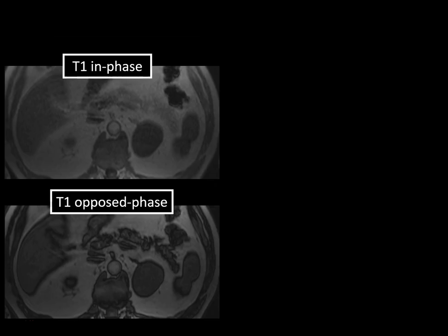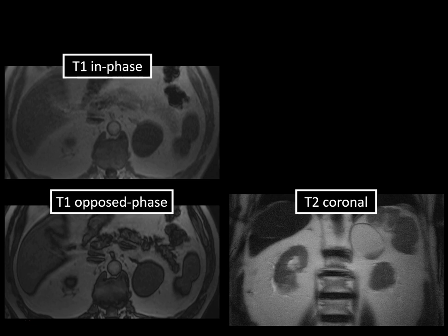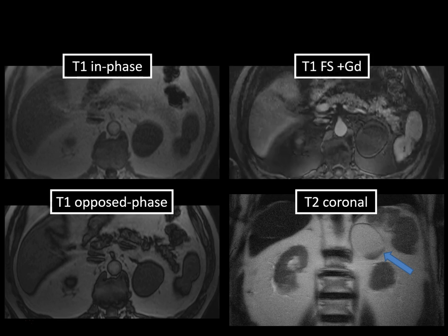Looking at the in-phase and opposed-phase T1-weighted images from the patient's MRI, this left adrenal mass does not lose signal on the opposed-phase image — it does not drop out. Therefore it's not consistent with a lipid-rich adrenal adenoma. On the T2 coronal series, the mass is extremely bright, similar to water, iso-intense to adjacent fat. There's also a small amount of layering T2 hypointense debris within this structure. On the T1 fat-suppressed post-contrast series with gadolinium, the mass is completely non-enhancing and dark on T1, consistent with fluid. This is typical for an adrenal cyst.